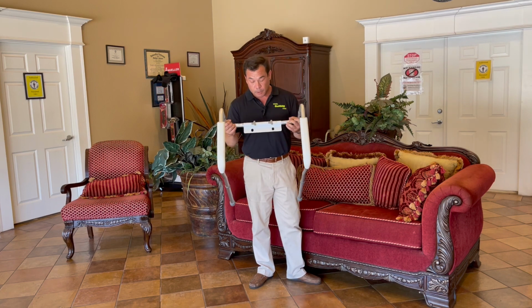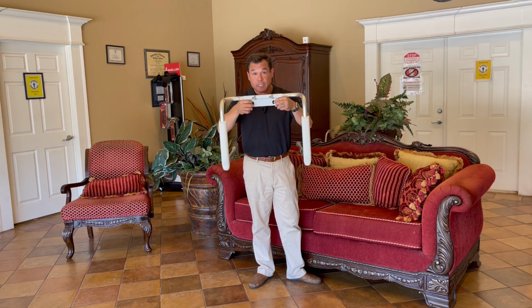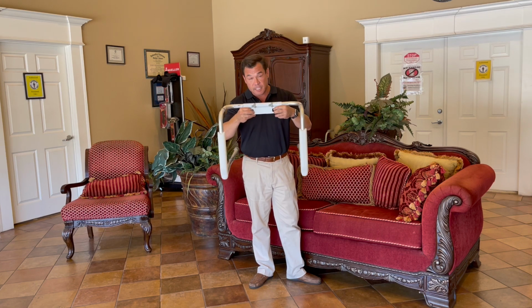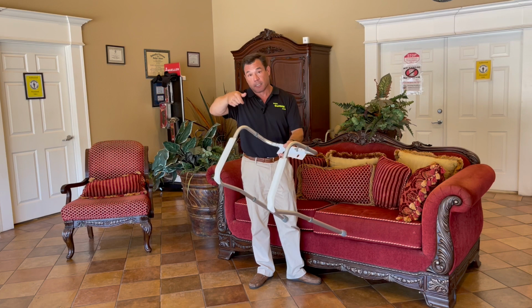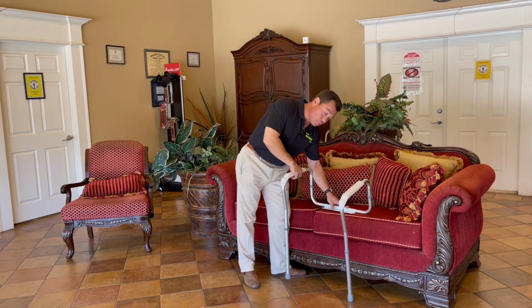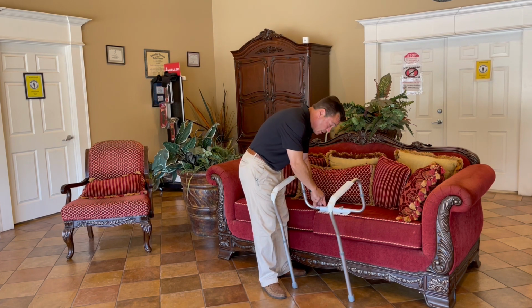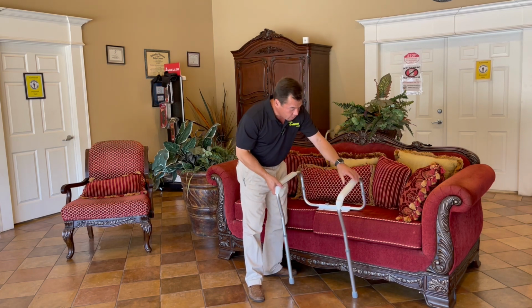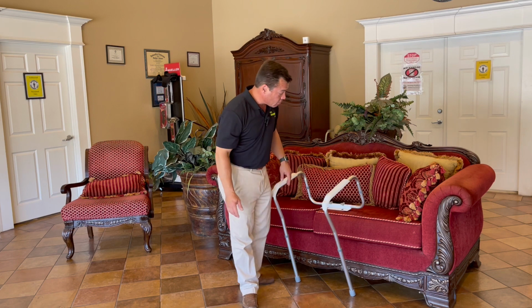Now, to attach this to your toilet seat, you need to take off your toilet seat itself, the ring, the seat, etc. And you can use a penny, because it's a big plastic screw in the back of there. Then you're going to put this on here, put your toilet seat back down, and screw it back on through here. What this does is give you a seat and these arms.